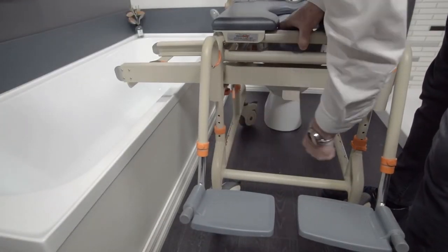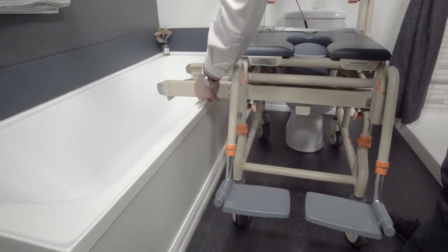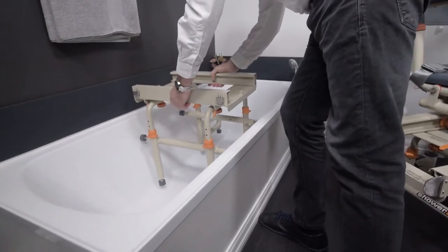To set the unit up you must firstly set the chair height, allowing the connected bridge to clear the top of the bathtub. Set this height to the nearest height hole above the bathtub.